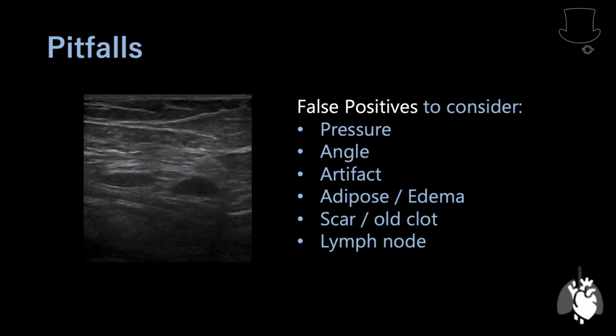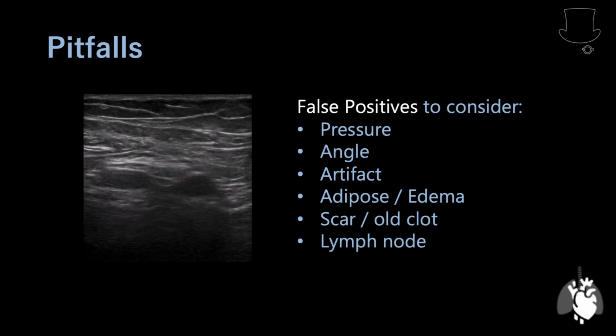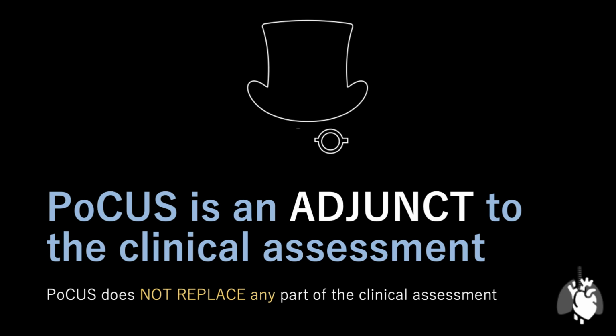So, you think your patient has a DVT, you did your exam, it was either positive or negative. Well, what are you going to do next? Of course, POCUS only works in the context of all these other factors, but how do you necessarily interpret your findings? Here we go. I guess we're going to have to listen to part 2.